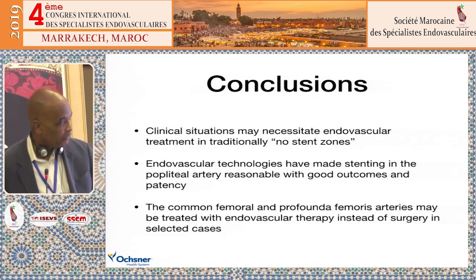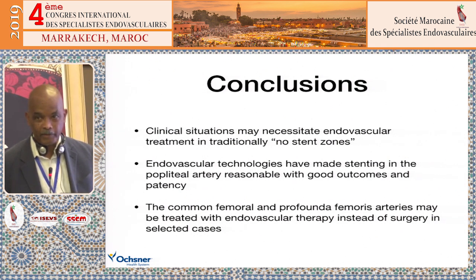And certainly the common femoral and profunda femoris arteries may be treated with endovascular therapy instead of surgery in selected cases. My group published, believe it or not, in 2001, stenting or angioplasty of the profunda, and you can imagine the heat that we got from that back then. But certainly, I think with the newer technology and with using your brain, we can take care of these patients and give them the best long-term outcome.